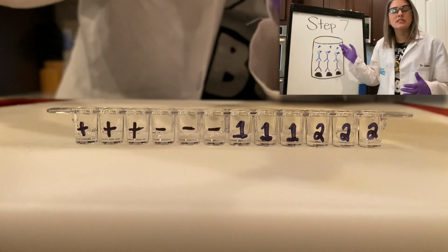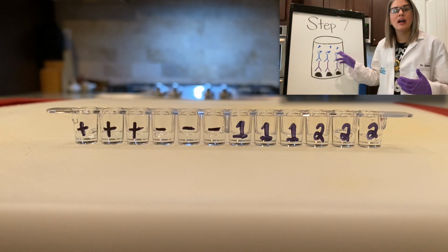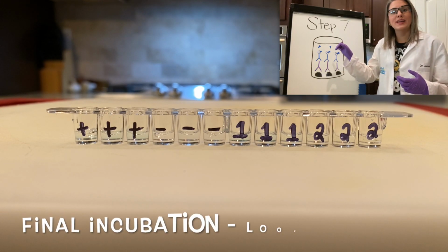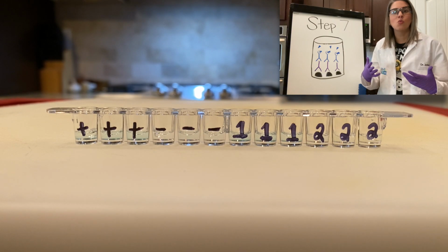That's our starting material or our reactants for our chemical reaction. They're gonna float down and they are going to bind or attach to the enzyme. That enzyme is gonna help speed up that chemical reaction, which is gonna turn those reactants into products. And in this case, the product is gonna cause a blue coloration. So in these next few images, I want you to start to watch the wells and see, do you see any blue?